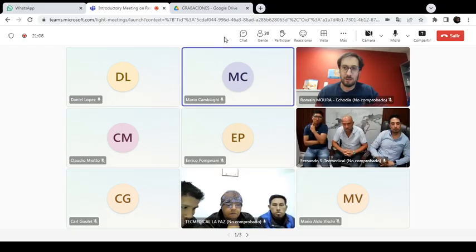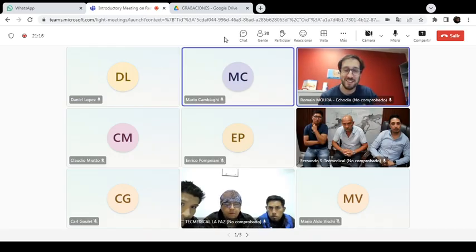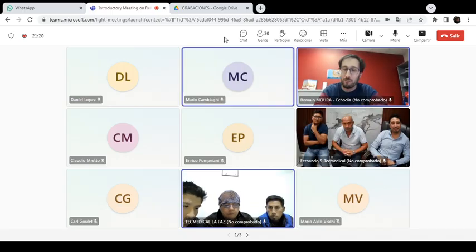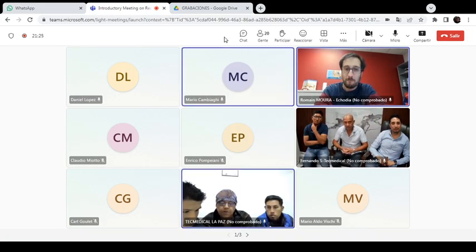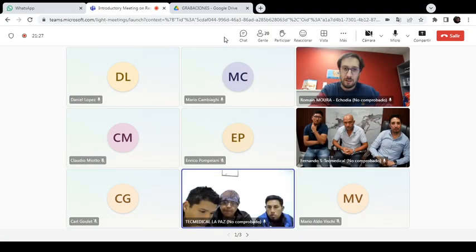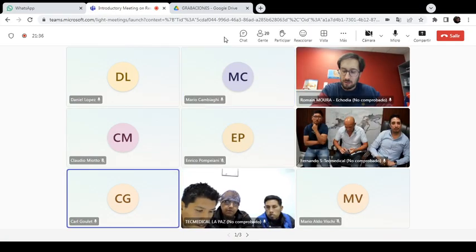Okay, so in this case we need to translate for you, Romain. Sorry, I don't understand Spanish, so please in English. I got that you are talking about the stimulus in ABR, but I don't get the whole meaning. The question we have with regards to the equipment is how the 2 stimulus channels work.